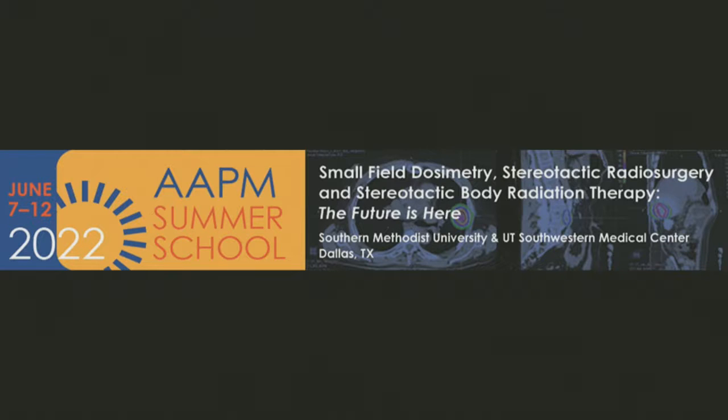You can run your model on those and see how well your model does. But when it comes to your specific patient, you have to have done that prior QA, like IGRT QA, but then, for example, translated to the deformable image registration. But you always need to look at the deformable image registration that you're getting, because it's really very individualized. The uncertainty is not global. I don't know if that helps, but there's much more work to do in that area, unfortunately.